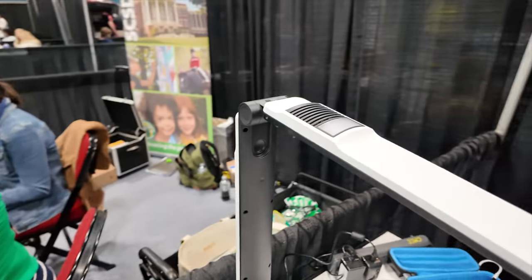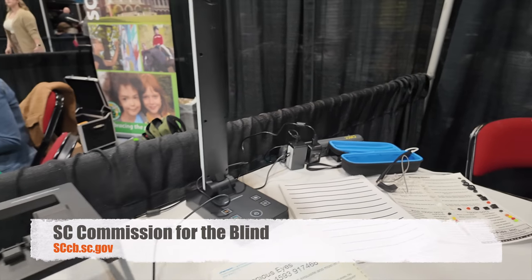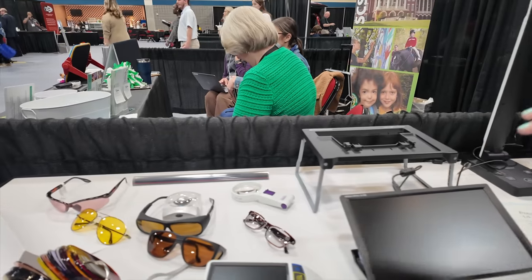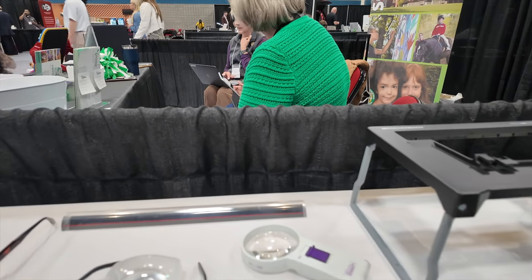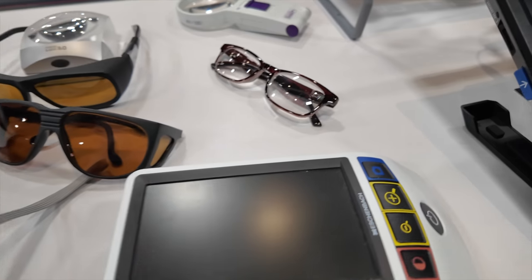That is a light to go with the magnifier. Does it have a camera? No, that's just a light. And then we have some of our different types of glasses and different frames, as well as lenses to help correct certain visual impairments.